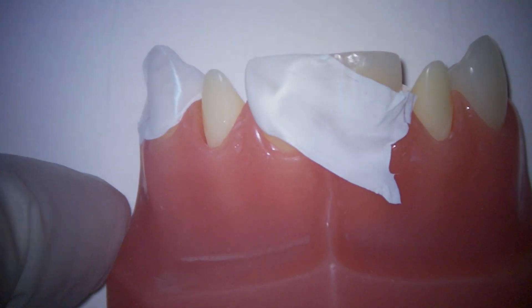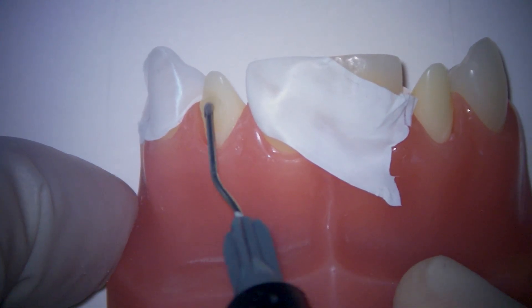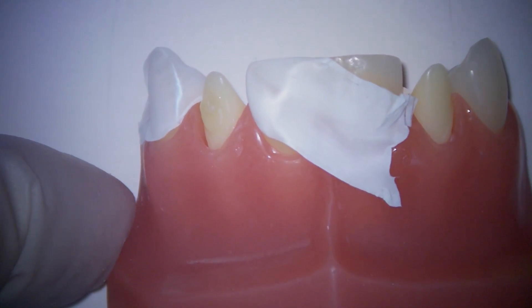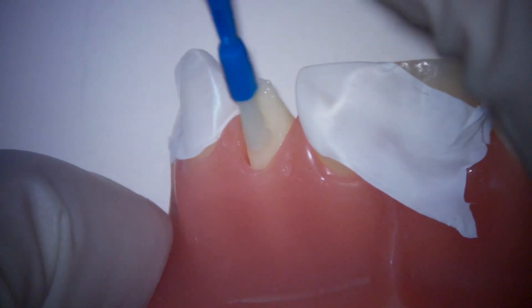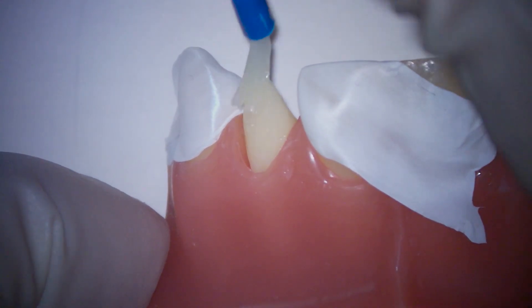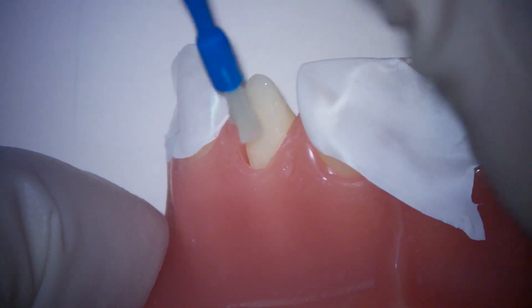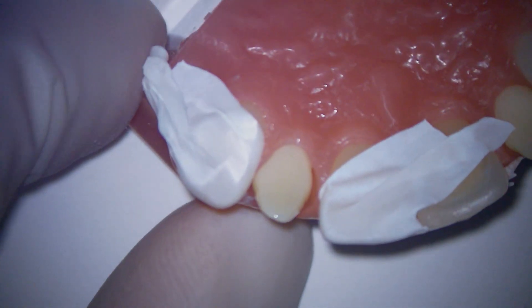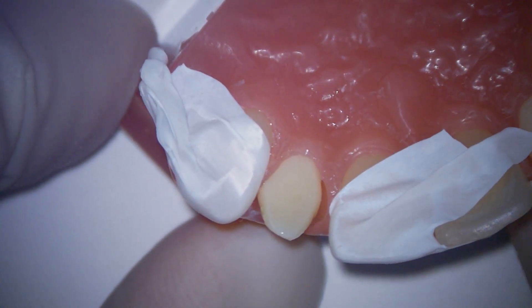One more tip to help you avoid air bubbles is to pre-wet the tooth structure. I normally take just a little bit of our flowable composite, place it onto the tooth structure, and then take a brush to ensure that we've wet the surface with the composite. This is going to decrease a lot of our surface tension and again help us avoid little voids. It also ensures that we have really nice intimate contact and bond from the flowable to the tooth structure. An important point: make sure that you do not cure this — we want to leave it wet and cure everything together.